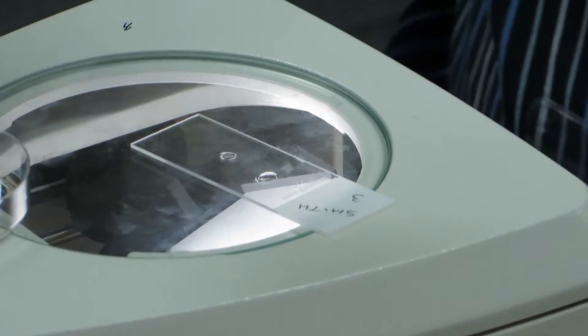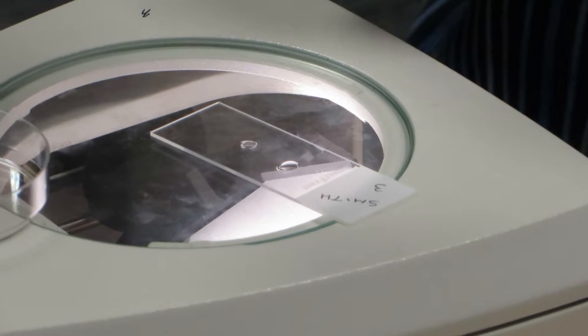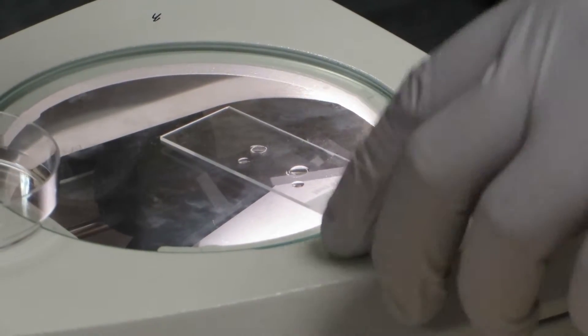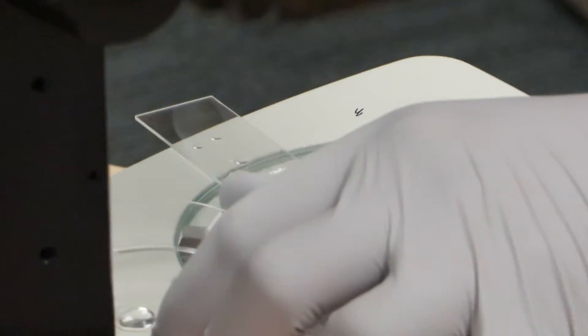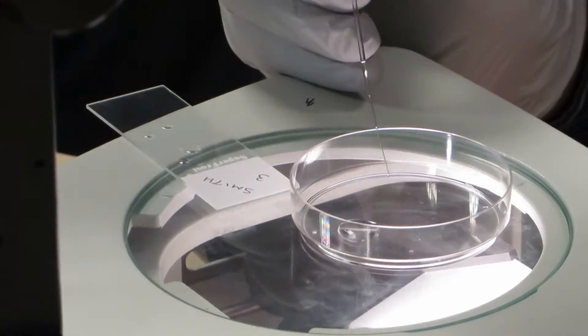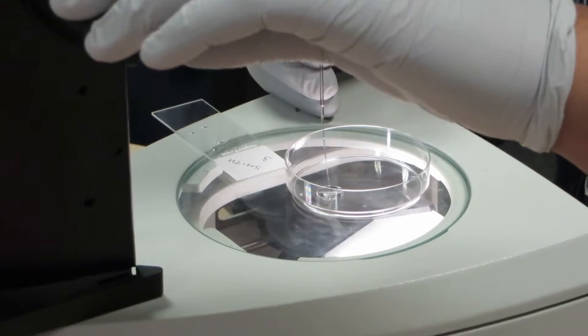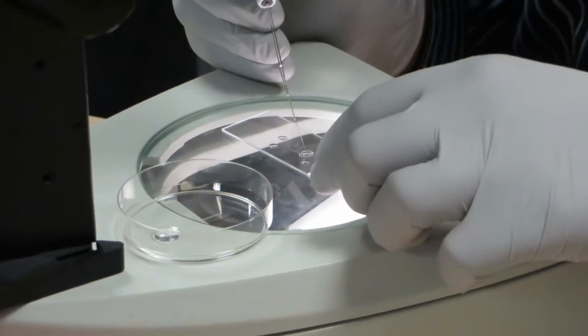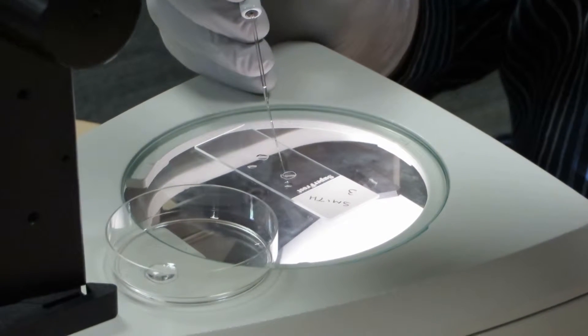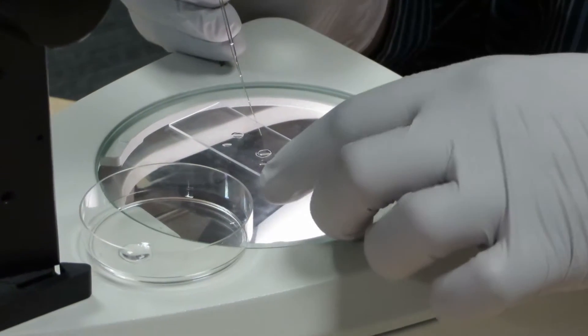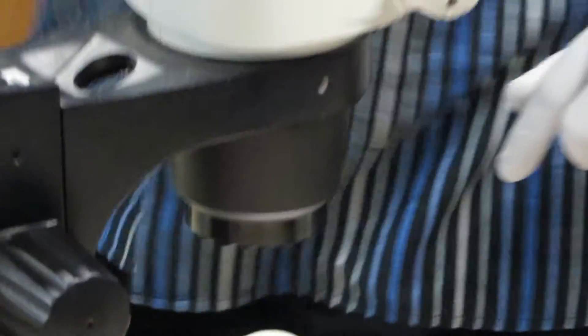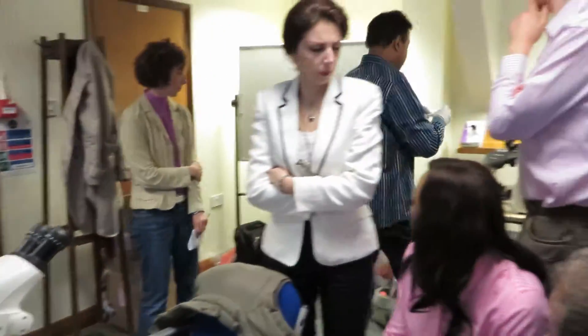So put a drop of spreading solution in the middle, then make a drop of PBS on the side. The PBS is there to wash your cell first and remove any oil that is there as a result of the biopsy dish. So you pick up your cell, first wash it in PBS, then in minimal carryover, release it in the spreading solution.